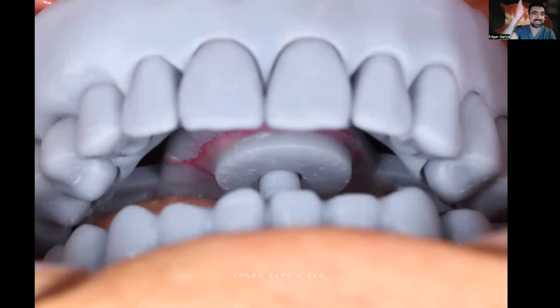Right. Normally when you have a Gothic arch and the patient moves forward, left and right, moves everywhere initially so that they can relax, they're hinging, they have the condyles in centric relation, hinging their jaw on one point, so you know that the condyles are fully seated. Once the patient has done multiple movements, you have them go forward and all the way back, left and back, right and back, and you're going to get a V shape, like an arrow shape, where those three lines match at the back of the plate. That's centric relation. And that's where you're going to put your little sphere, your little ring, so that you can lock that centric relation in place.